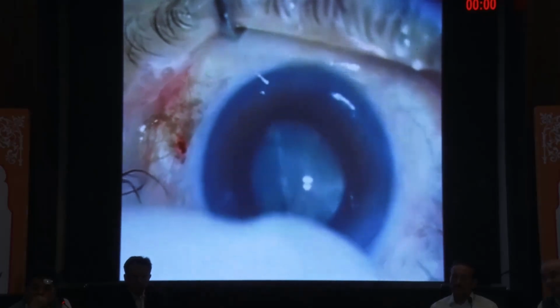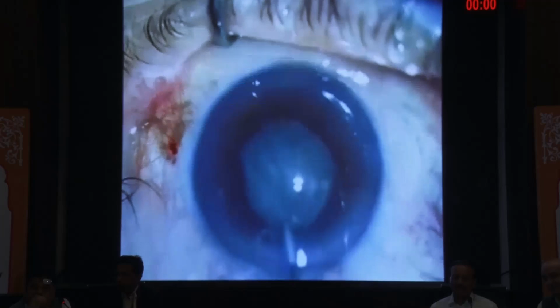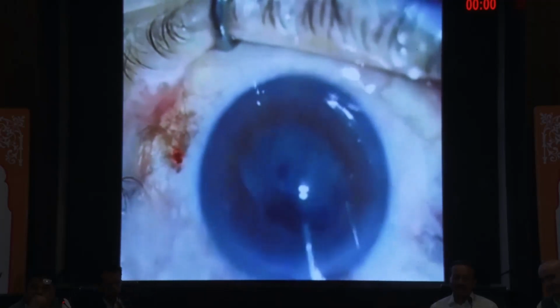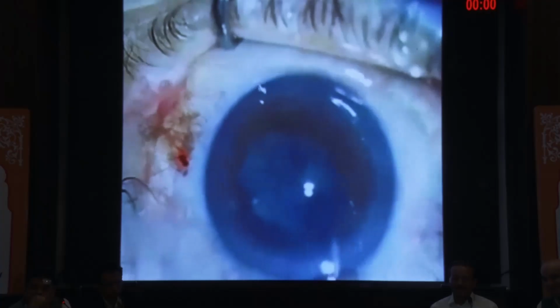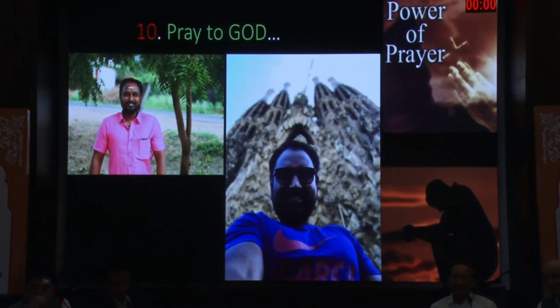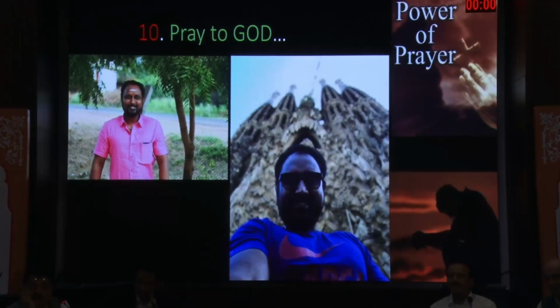The only time I say don't do a vitrectomy is when you do these hydros and you see the entire nucleus gone inside. At that time, that is the only time I tell you to avoid doing anything else. Just make sure you have a good VR colleague. And if you don't believe whatever I said so far, prayers do help when you go into the OT theater.